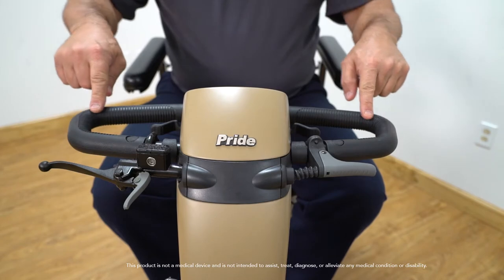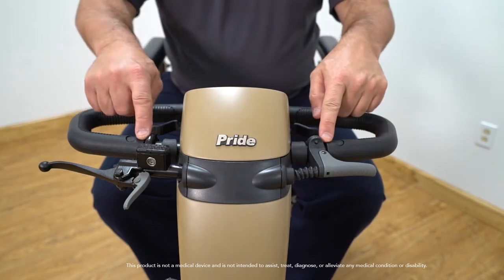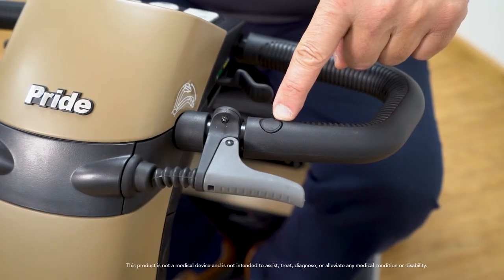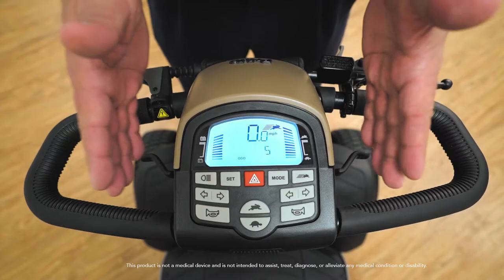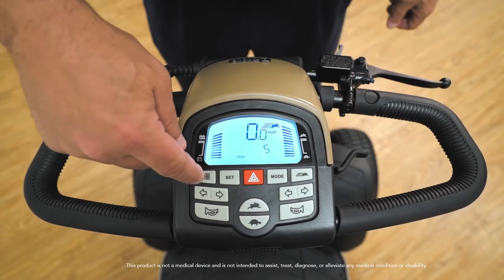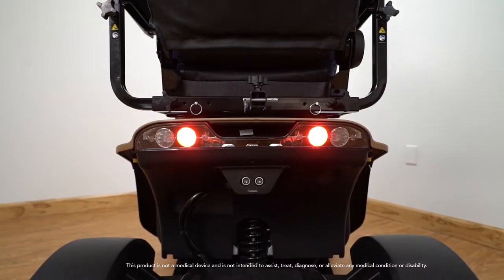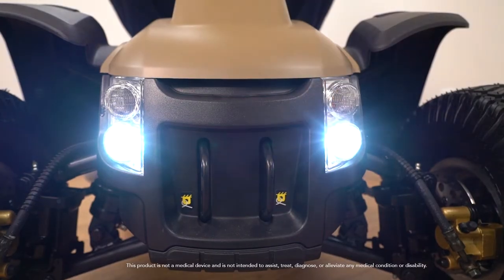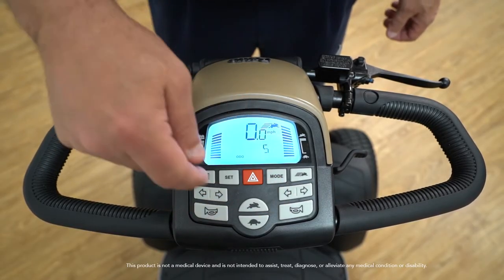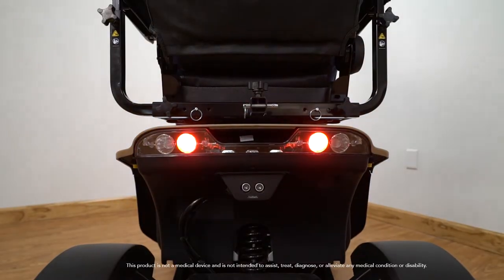The Wrangler comes with a delta wraparound tiller which allows for easy use of the throttle and steering. With the delta wraparound tiller, you can also add accessories such as a cell phone holder and rear view mirror. When the Wrangler is turned on, the user-friendly display will light up. You will see multiple buttons on the console including a switch to turn on the front and rear lights, turn signals, a horn button to notify others for your safety.